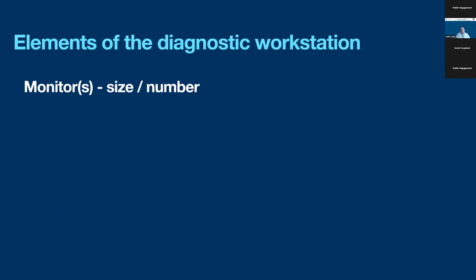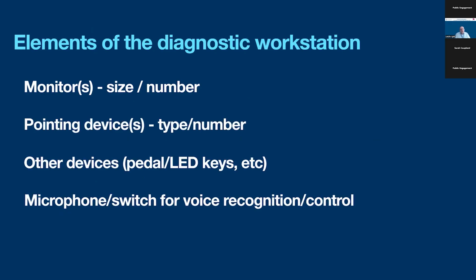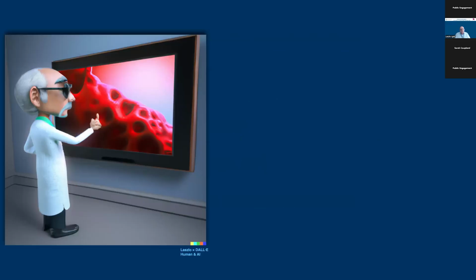Diagnostic workstations, obviously monitors, it's important the size and the number, the pointing devices, other devices, microphones, and the chair and sit-stand desk.